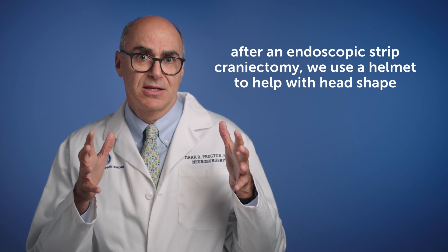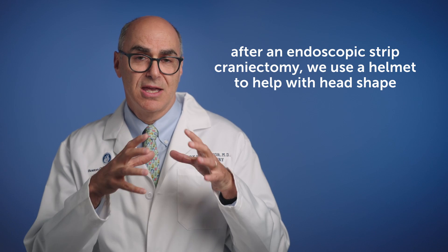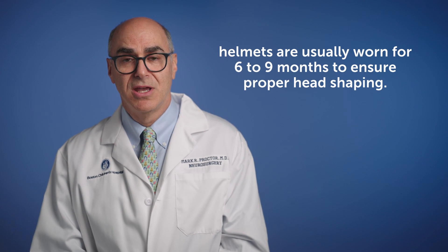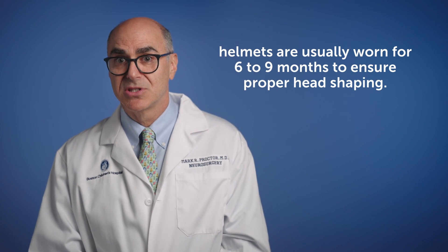After doing an endoscopic strip craniectomy and freeing up the skull bones, we now have to catch up with mother nature. So if the head is, for instance, overly long, we would use a helmet that keeps the length in check and allows the width to grow on about a two-to-one basis relative to the length. The helmet is really a key part of the operation. We do the operation and then three to seven days later the child is fit for a helmet, which they'll wear generally for six to nine months.